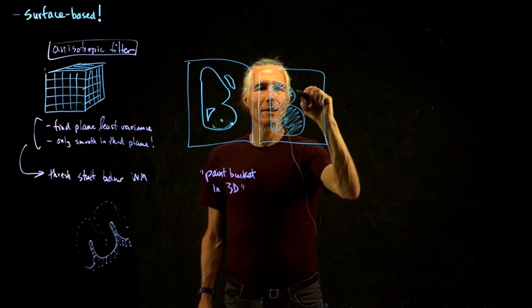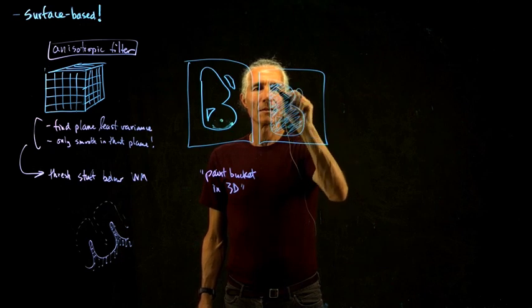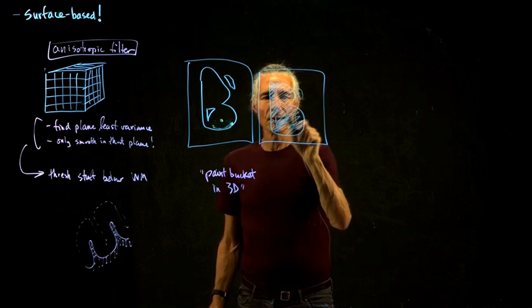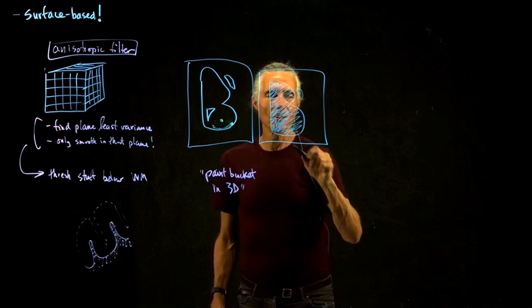There'll be a void out here. It won't do anything to that guy. So it'll fill up that. Okay, so that's pretty good. But you've still got that ventricle in there. We don't want that. That's not part of the cortical surface.